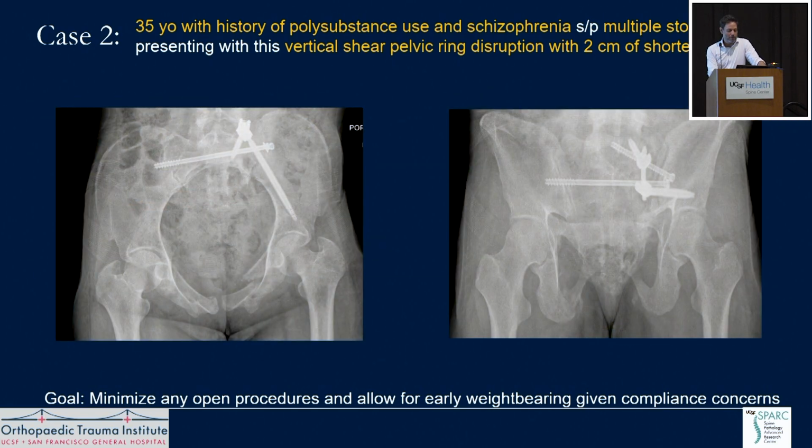So this was her final construct, and she was allowed to weight bear immediately. And this is her at 8 weeks where everything is holding.